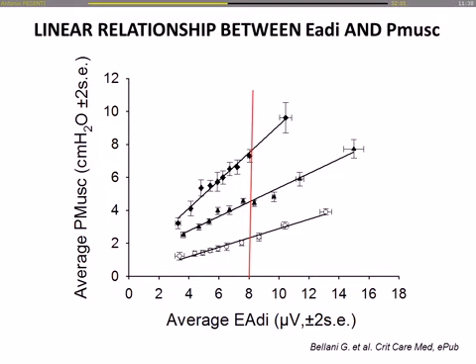These are 3 different patients. You see that the relationship between the electromyographic signal and the pressure developed by the muscles is quite good. It's a pretty straight line. But these lines are different from patient A to patient B to patient C. I know that if the signal increases, probably in that patient, the developed force is increased. But I cannot compare this patient to this patient.